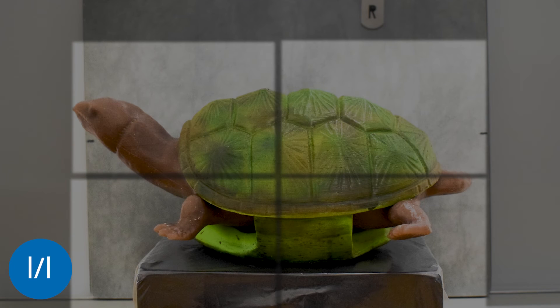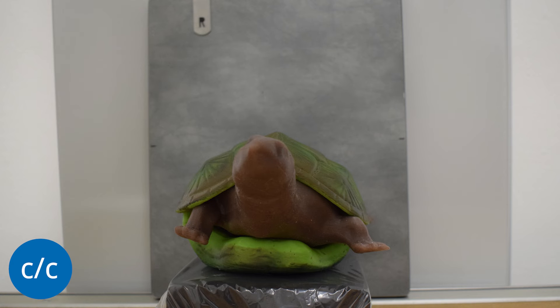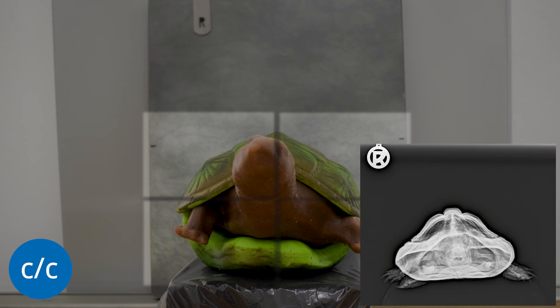During the lateral-lateral exposure, the x-ray machine is aligned laterally towards the turtle; in the cranial-caudal shot from the front. In this case, it is important that the animal is not fixated manually and that the limbs are not in the shell, otherwise overlapping will occur.